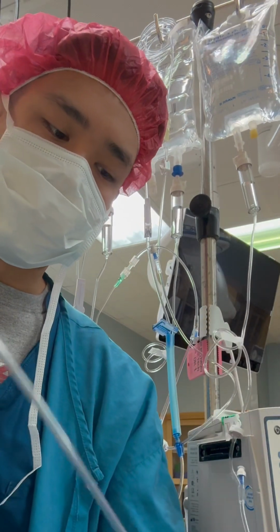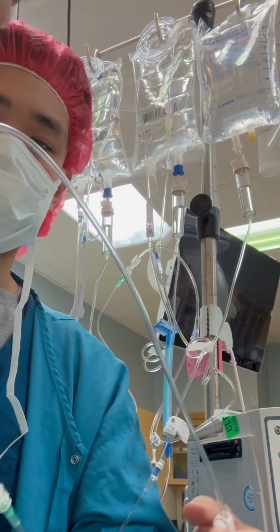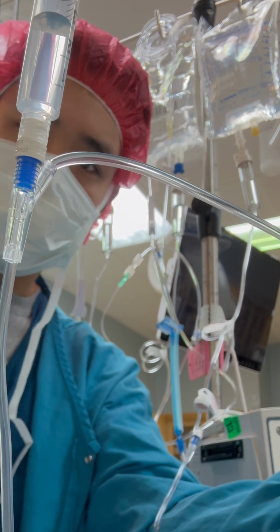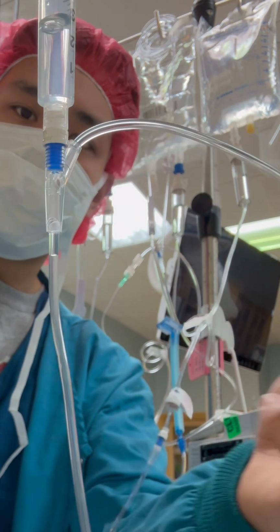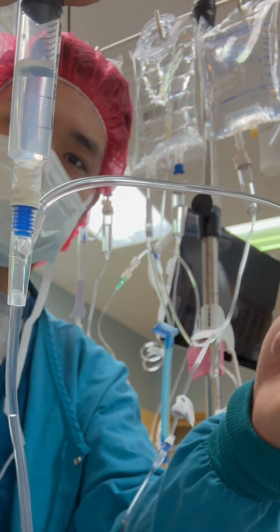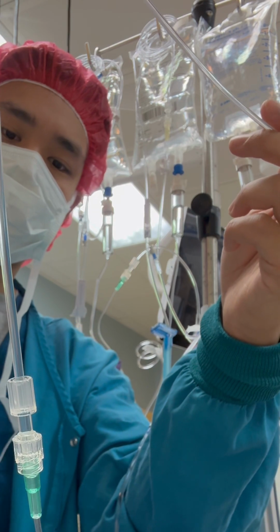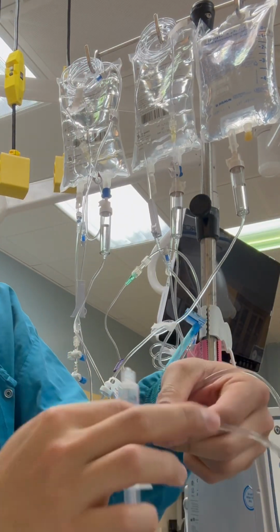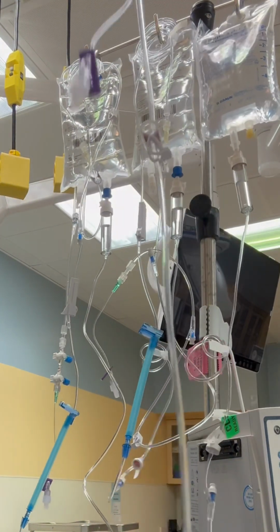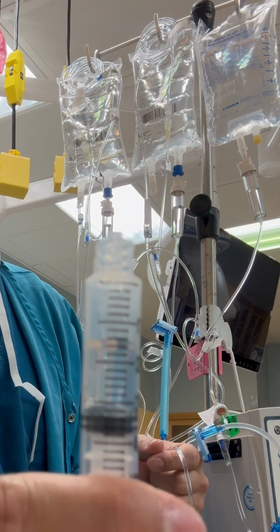Now this last port is after the last roller clamp or pinch clamp. So you want to do the same thing, unclamp, but when it passes, clamp, aspirate the air. But you have 3 cc's of saline already. You can just flush the rest of the tubing with that. And you just primed an entire IV set with a 500cc bag with 1.5 cc's of fluid loss.